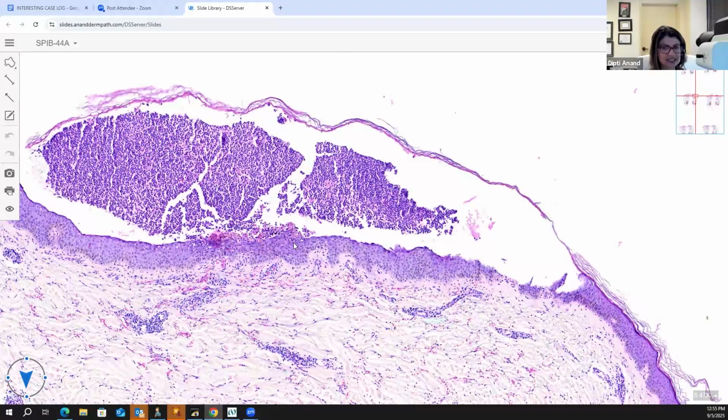What this clearly isn't is staphylococcal scalded skin syndrome, because it's too inflamed for that, and that's a paucicellular subcorneal blister. Then come to pustular psoriasis, then come to pustular psoriasiform drug eruption, which is AGEP, which it is also not because there are no dermal eosinophils. If you had this pustule and you had dermal eosinophils, it would be AGEP, okay?